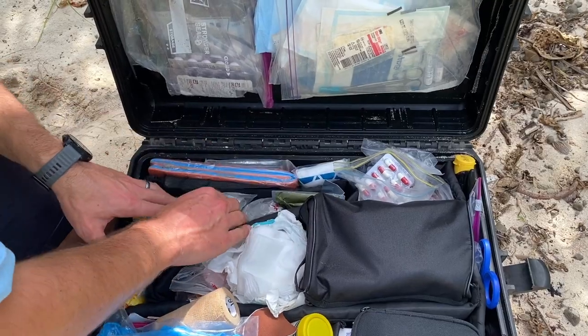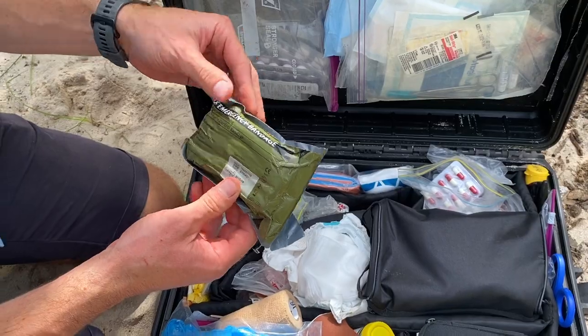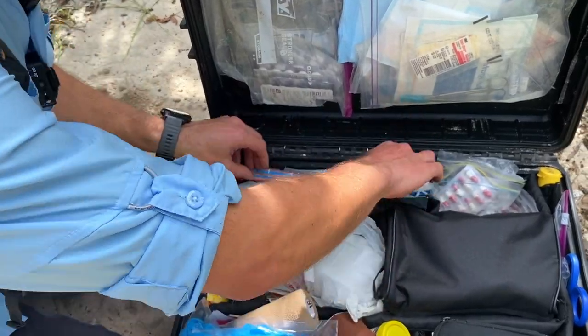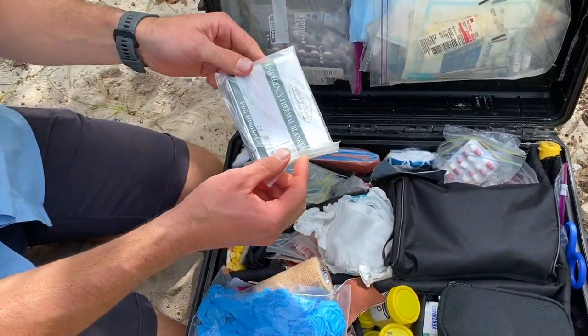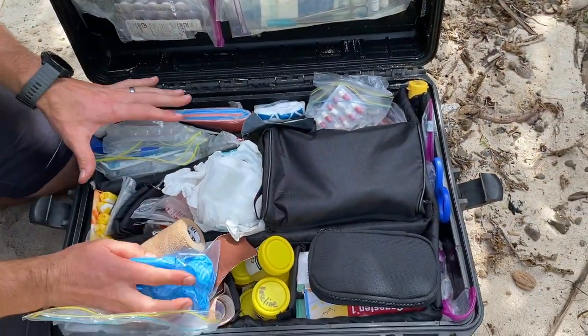A bit more of the emergency trauma-type stuff up here. I've got an emergency haemostatic dressing, a triangular bandage, a SAM splint — very, very useful, and it tucks in there nicely — and a foil blanket. So that's this part of the kit.